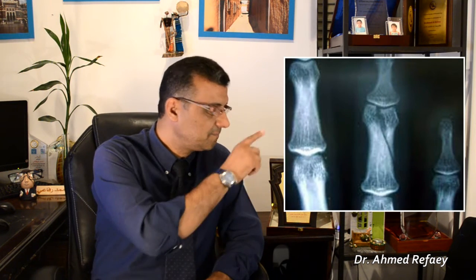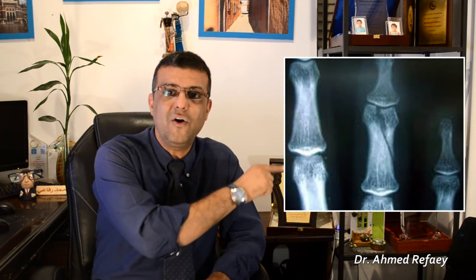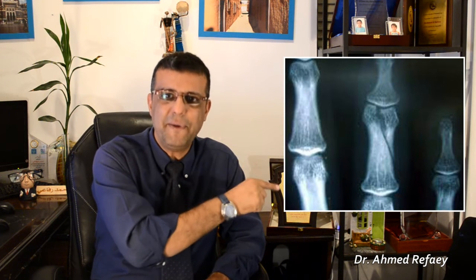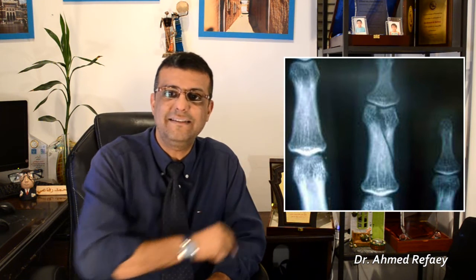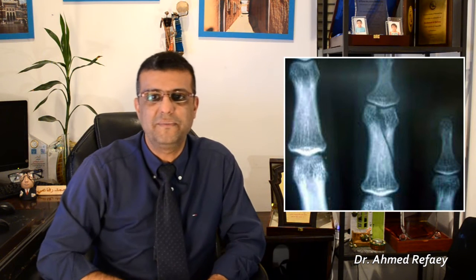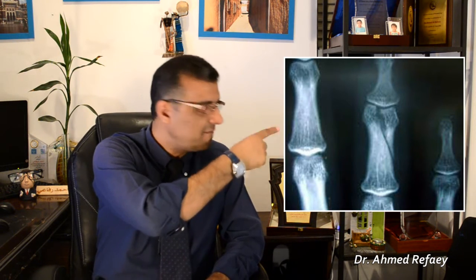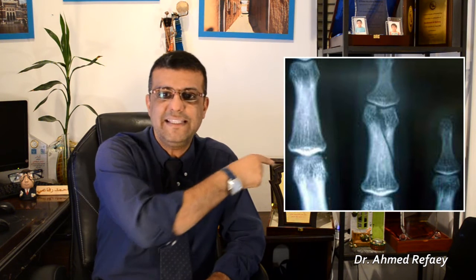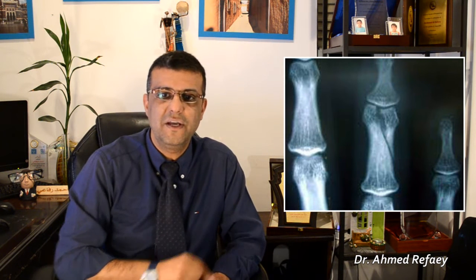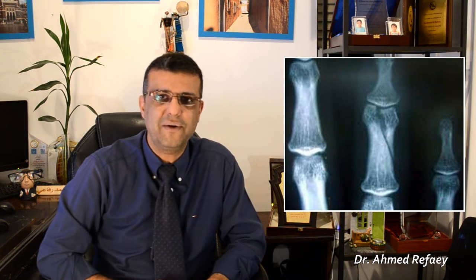Case number two. This is a complete, oblique, simple fracture of the distal end of the middle phalanx of the fourth finger. It is intraarticular, as the fracture line is reaching the articular surface. No significant displacement, angulation, or shortening could be appreciated.